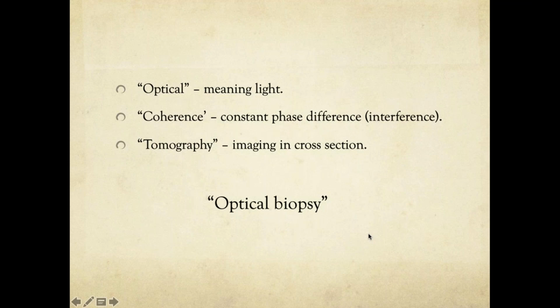Is that, for example, in a case of diabetic retinopathy, you have the first indicative sign in the clinical fundus examination, that is your microaneurysms. So those microaneurysms can be detected using optical coherence tomography, and those microaneurysms can even be analyzed, where they are, what the flow type is, using optical coherence tomography angiography. So that's a non-invasive optical biopsy.